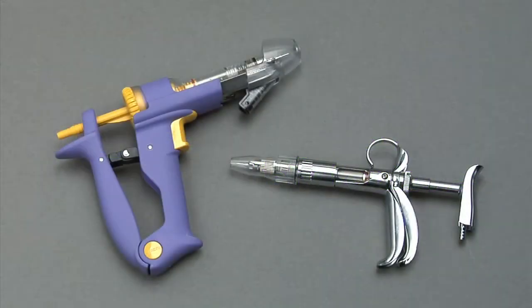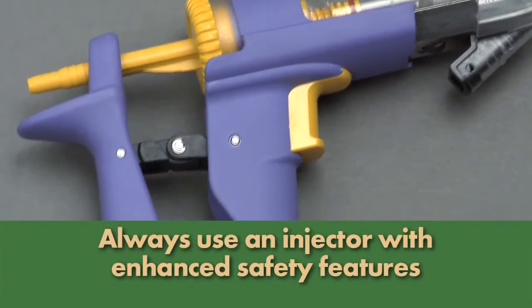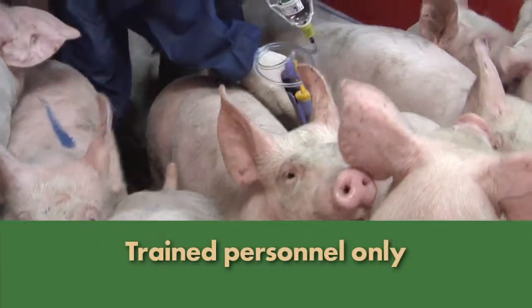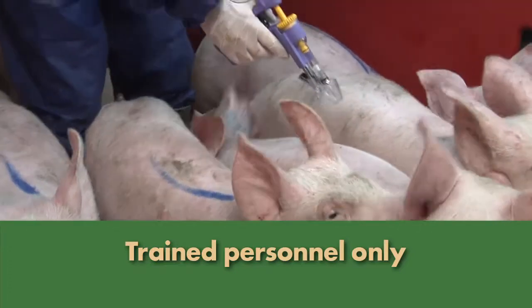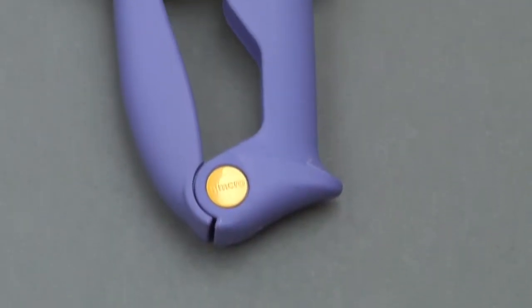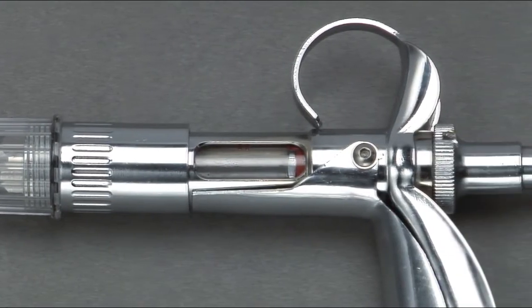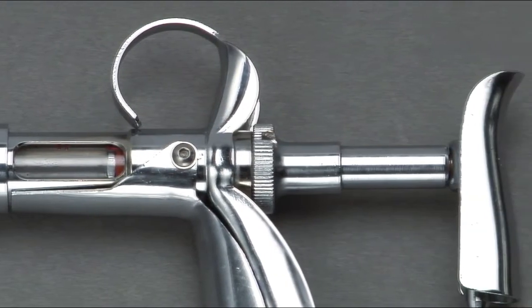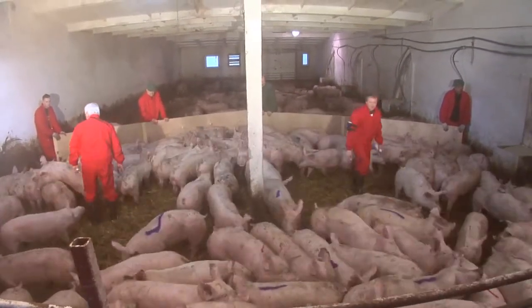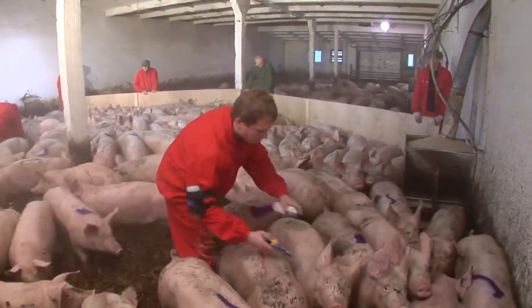Improvac must be administered using an injector with enhanced safety features. Pfizer Animal Health strongly recommends that all personnel who administer the vaccine must first attend and successfully complete one of the company's training workshops. These injectors have a number of in-built design features which greatly reduce the risk of accidental needle stick injury or self-injection. In addition, they are designed and balanced to make single-handed use easy and comfortable, so large numbers of pigs can be injected in one session without undue fatigue.